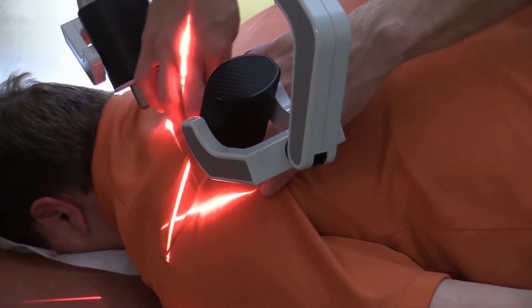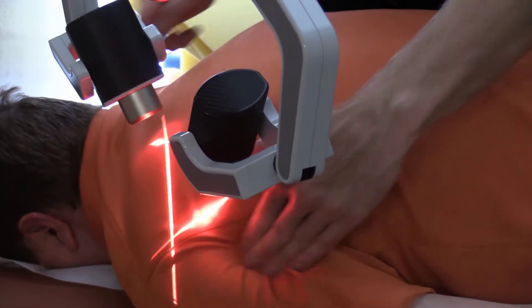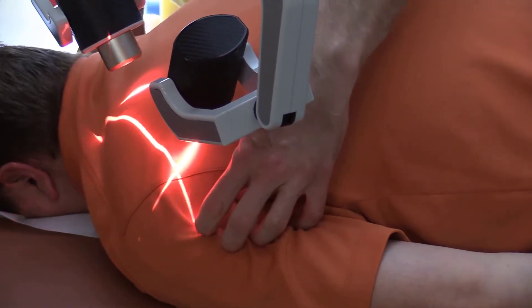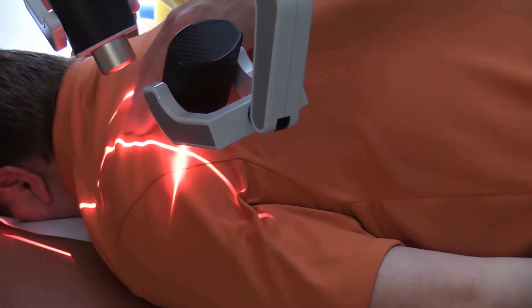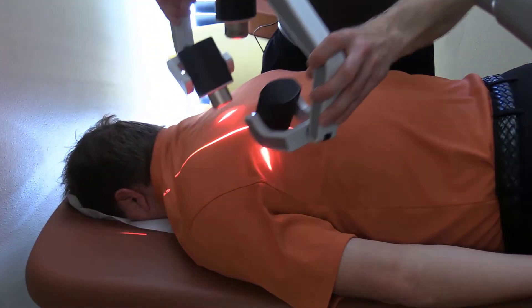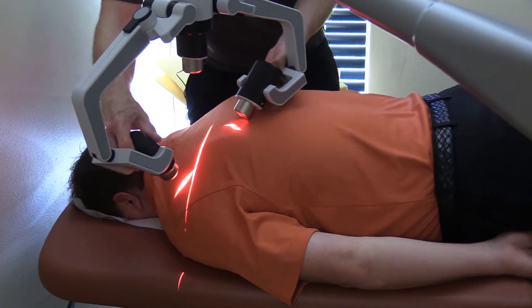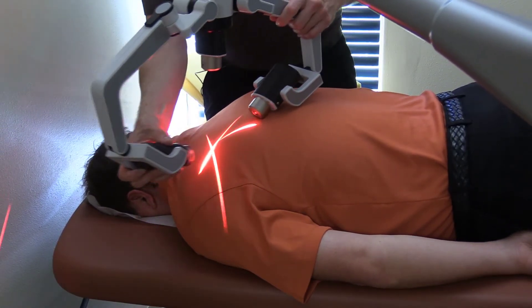There's a good knot right there — that's a good spot to get. Down here I don't feel anything, but there could be problems I just can't feel in this position because everything is so slack. Here, this kind of stands out and I can feel this. That's how you do that, and this is a good way to use that middle laser more effectively, especially if you go at an angle and get the middle laser a little closer to the person.